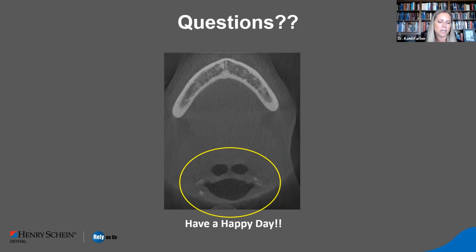So they have not used the terminology standard of care. They've kind of avoided it and left that up to the clinician, because some of the older dentists or oral surgeons have maybe placed thousands and thousands of implants with 2D imaging, and they're really good at what they do. That's not to say that mistakes can't happen though.